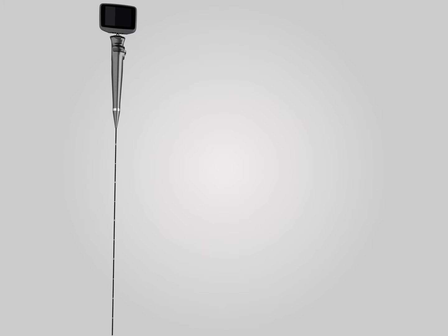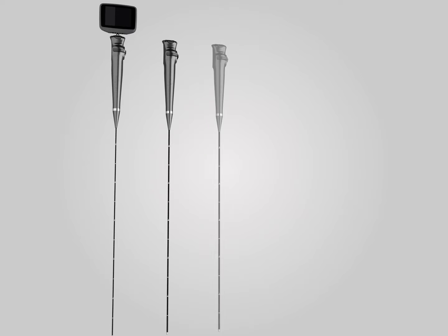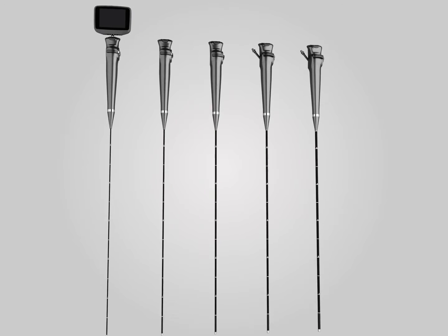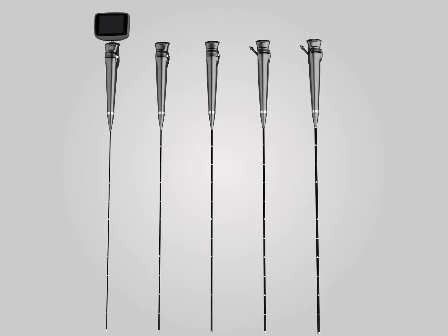The INSIGHT IS3CF Video Flexible Laryngoscope series have different models. Their outside diameters range from 2 mm to 6 mm, and inner diameters range from 1 mm to 2.8 mm. They meet doctors' requirements in various clinical applications.